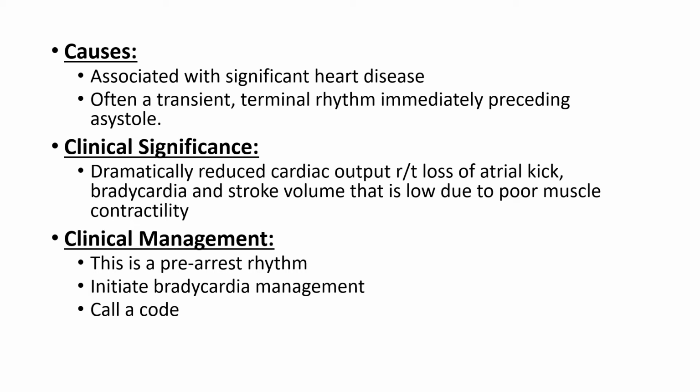The heart, again, your SA node failed, your junction failed, so the last resort is a pacemaker, and it's so weak and very slow, you probably barely have a pulse, if any. It's basically what you call a dying heart, or agonal rhythm sometimes.